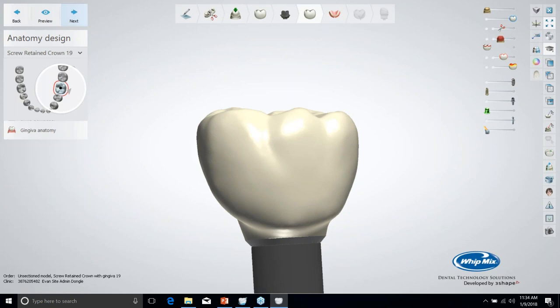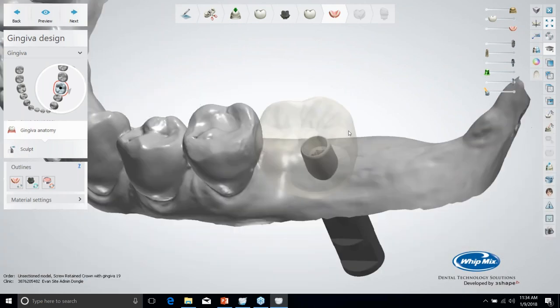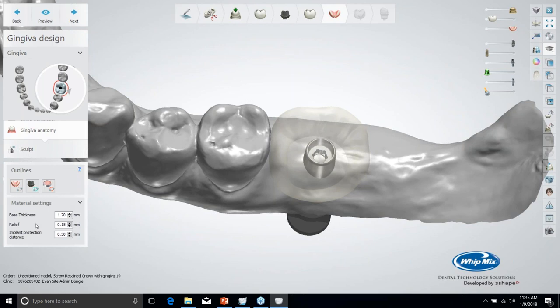This will just be showing tissue on one unit, but when you do it on multiple units, you don't have a tissue step for each crown. It's a tissue step for the entire restoration. And the same steps will apply no matter how many units you have. So when we get in, we'll be on the gingival anatomy. Under outlines, you've got three different buttons and a drop down for material settings.